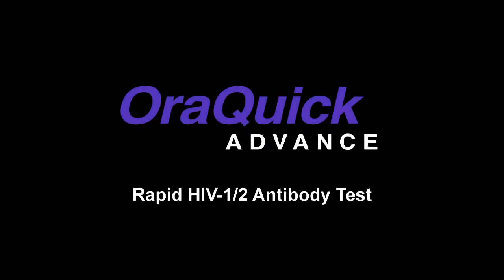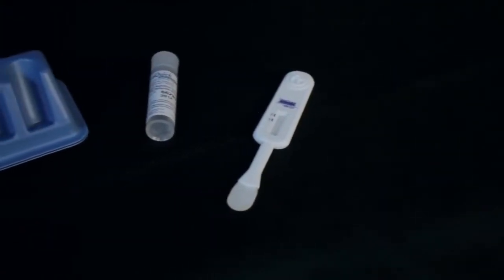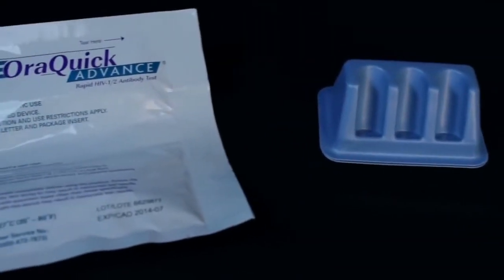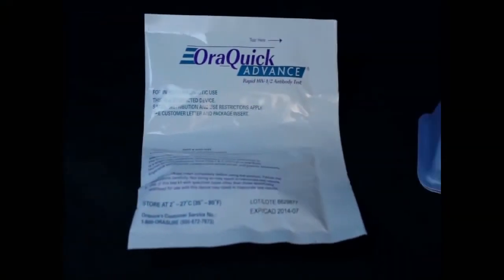Thank you for choosing the OraQuick Advance Rapid HIV-1 and 2 antibody test. This video will demonstrate the proper way to use the tester for the best results. The steps must be followed closely. Since no test or test kit is infallible, it is best to confirm test results by using a licensed medical testing facility.